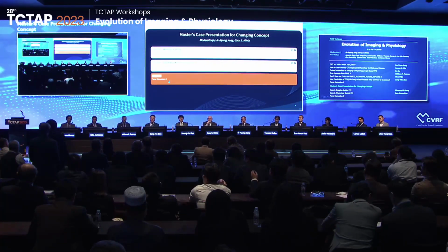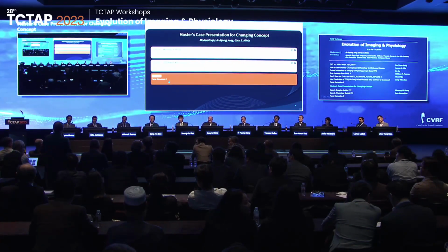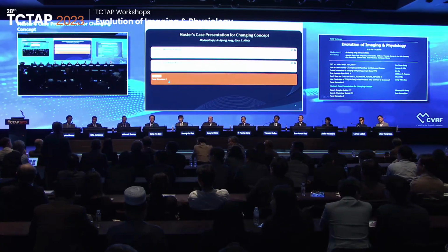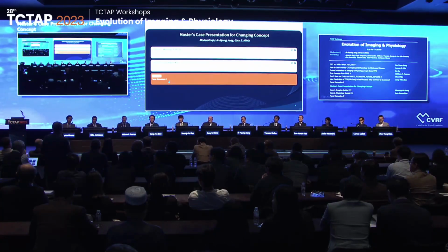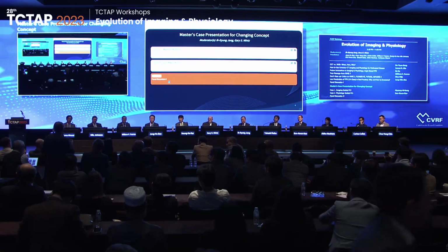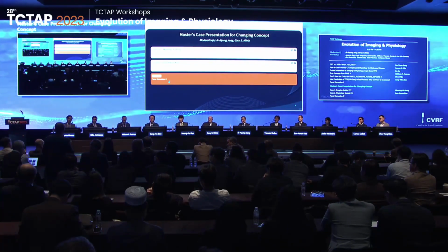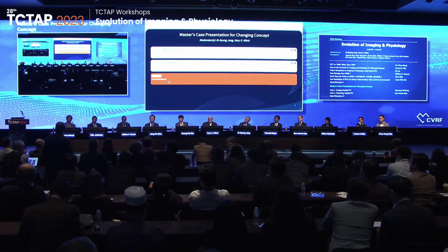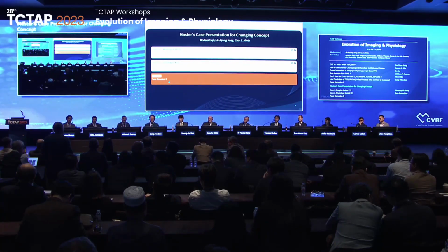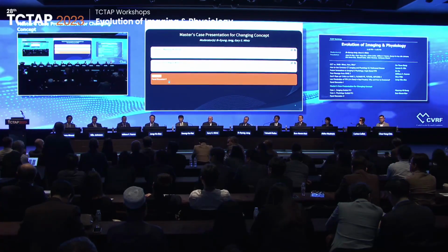Thank you. The last comment is from Antonio. I have a question: how do you see using IVUS for decision-making to treat? I see many young people do FFR, the FFR is 0.85, 0.84, then they do IVUS and see a lot of plaque burden. The cross-sectional area is 3.8 in the LAD, FFR is not abnormal, but there is a lot of plaque burden. How should we use IVUS for decision-making, or should we only use FFR?